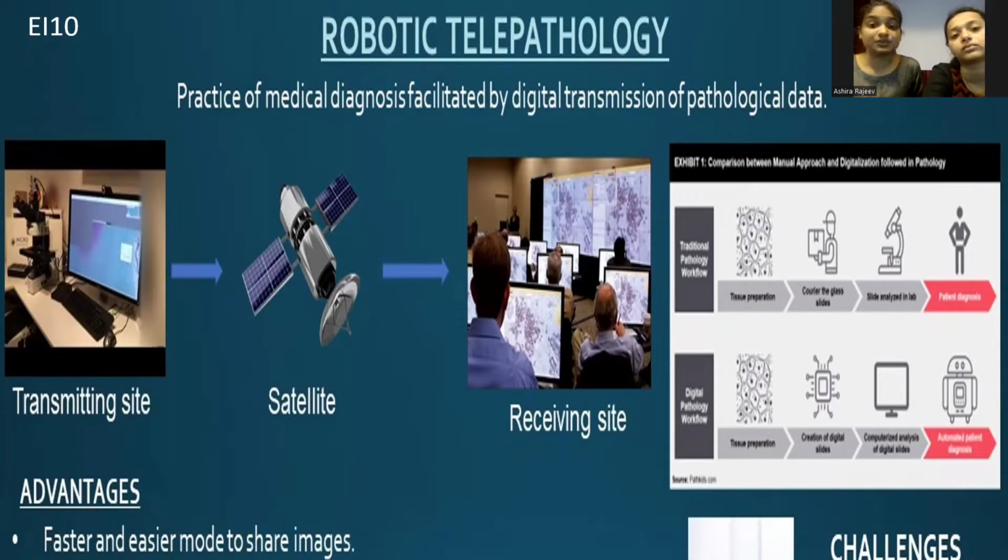Telepathology can be classified into three types: store and forward telepathology, dynamic telepathology, and hybrid telepathology. Store and forward telepathology involves capturing of still images and transmitting them in an asynchronous mode. Dynamic telepathology is a real-time method which transfers video stream from a remote site to the telepathology service with the digital or video camera. Hybrid telepathology is a method which combines both static and dynamic telepathology methods.